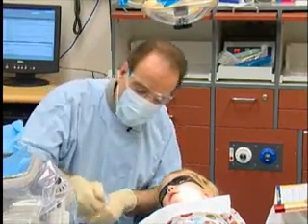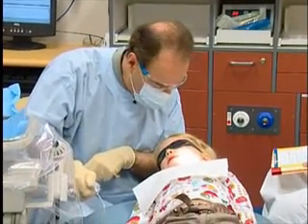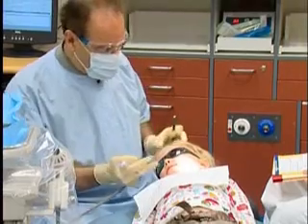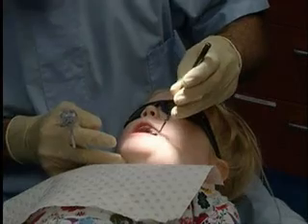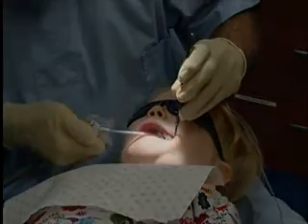Just to dry it, look, the air comes out of this. Can you feel the air? Can you feel that? I'm just going to blow some air like that on one of your teeth, just have a better look. Open it really big for me, please. As big as you can.